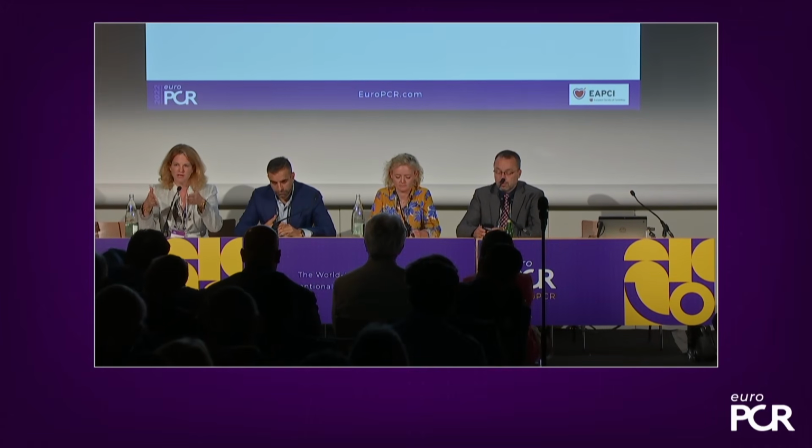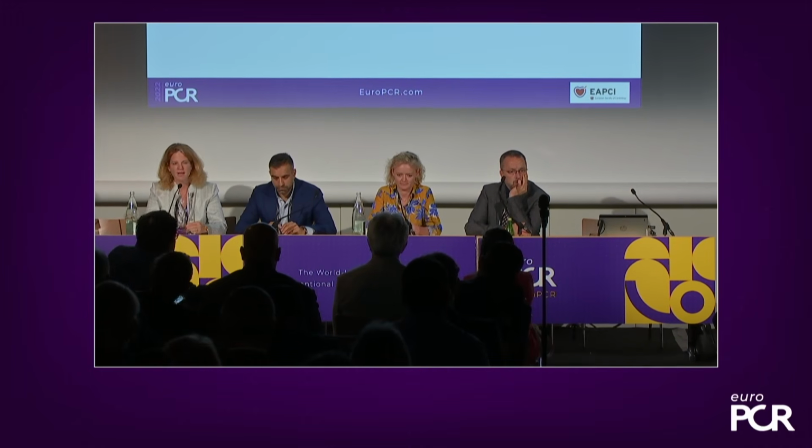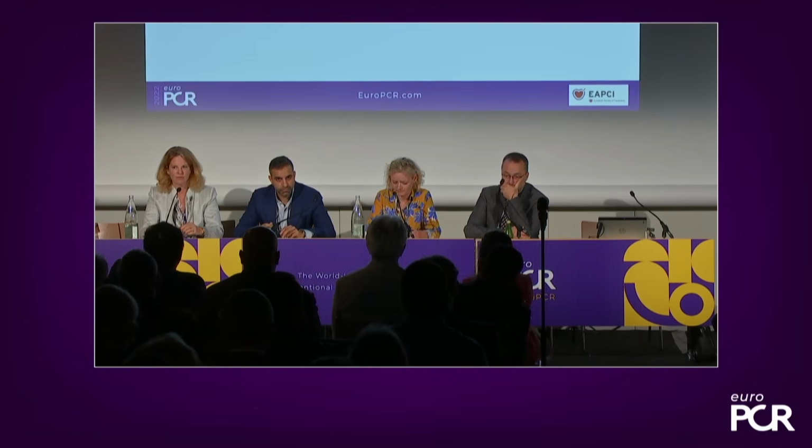For the IVC, it's important that we have the diaphragm, where you have the hiatus of the inferior vena cava into the right atrium. The diaphragm gives kind of an anchorage to the upper part of the valve. So if you place your valve there and the tissue-bearing segment has the highest radial force, then you can expect a good anchorage. The second part is the lower part of the valve, which will expand into the vessel wall.